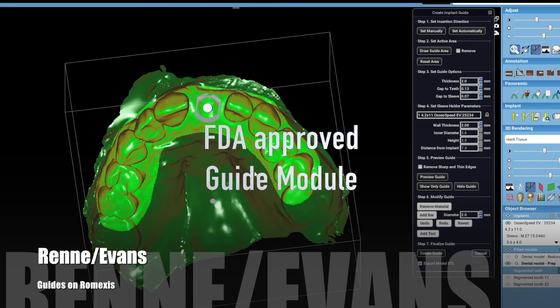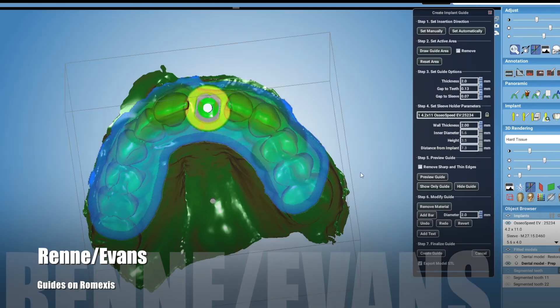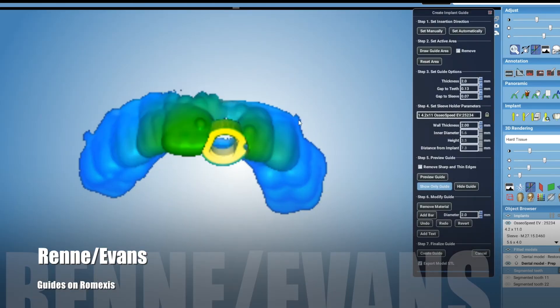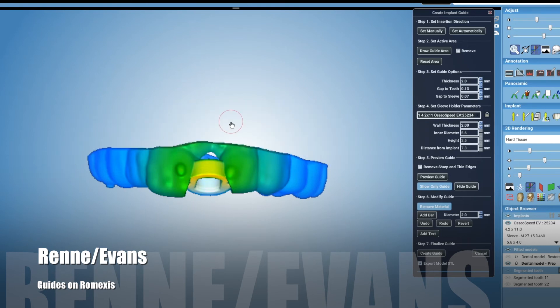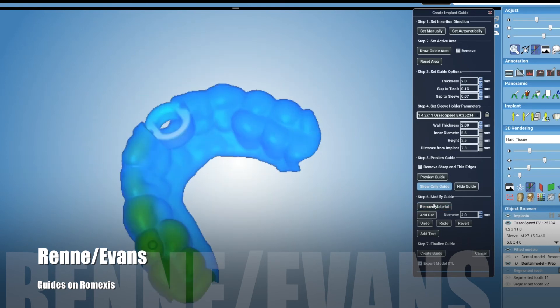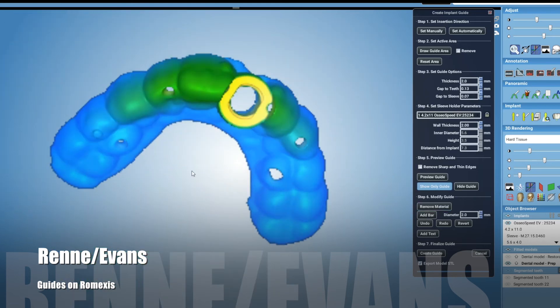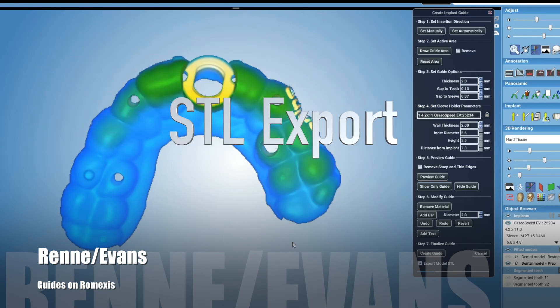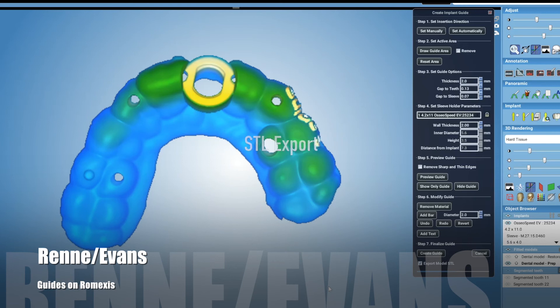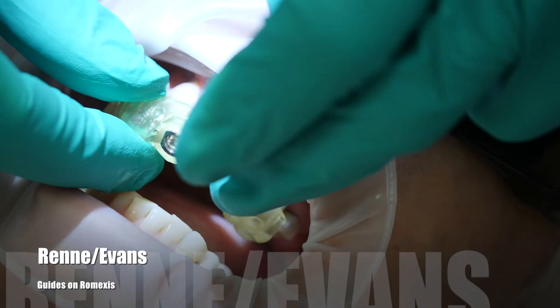Now with everything positioned the way I want it, I go ahead and design the guide. I fine-tune the sleeve parameters based on my surgical guide drill kit. I'm removing material from the guide and placing some holes for verification of seating. Then I'll stamp it with the patient's name, export the STL, and import it for 3D printing into any system.